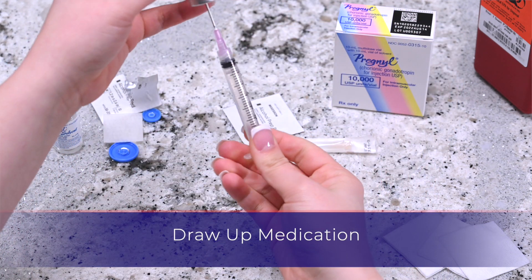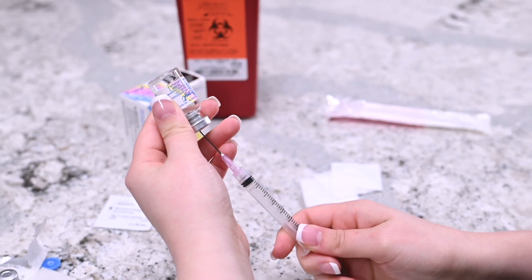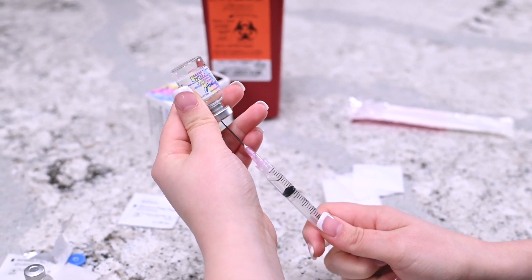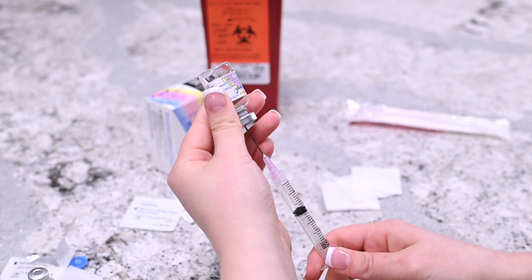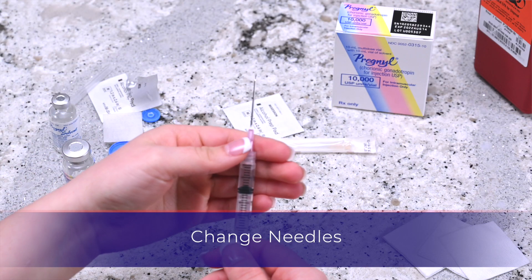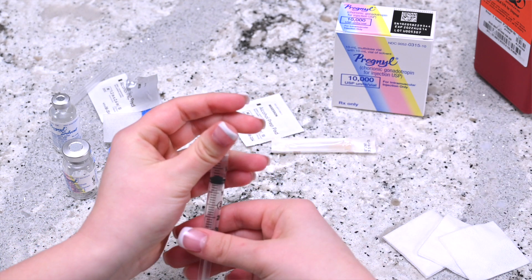Invert the syringe so that the vial is upside down but still attached to the syringe. Pull the plunger back until all the content from the vial resides in the syringe. Remove the needle from the vial. Gently twist and remove the needle from the syringe. Dispose of the needle, placing it into the sharps container.